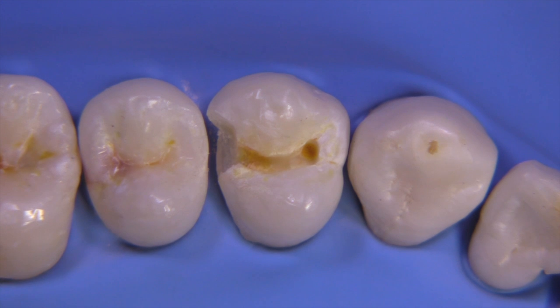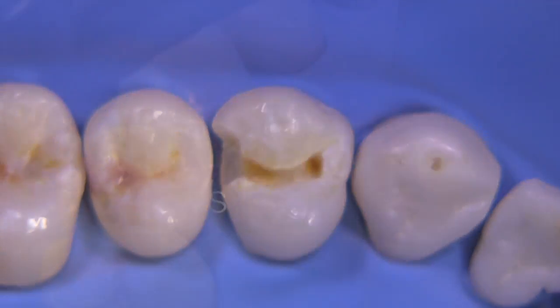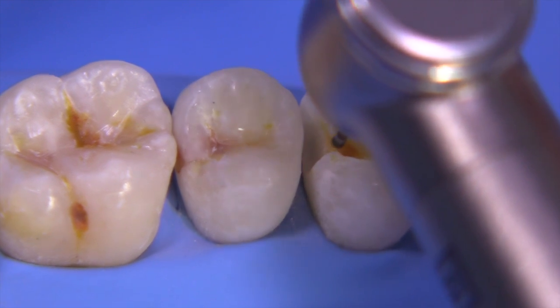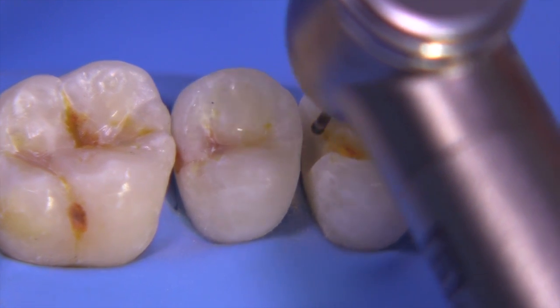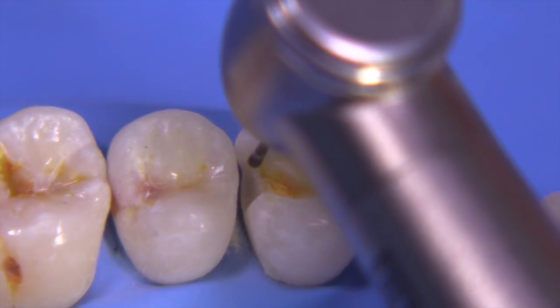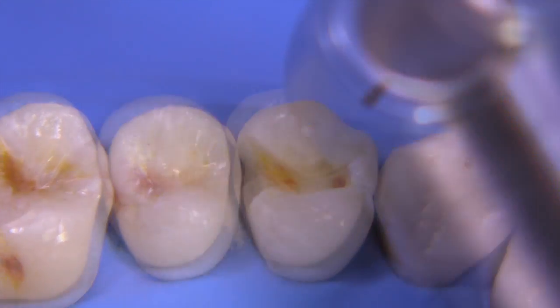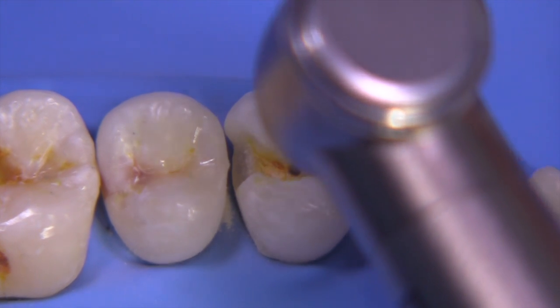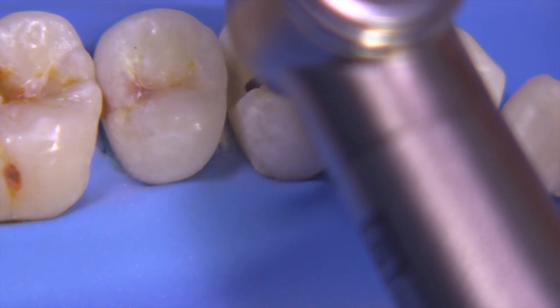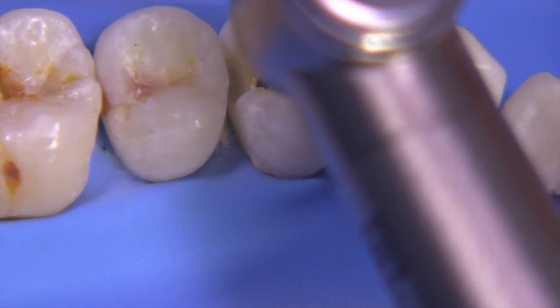Let's switch over to the 330 RGS to do some smoothing of the S-curve and open up the outline a little bit so we'll have better access to the caries removal process. The 330 RGS is ideal for generating the S-curve, maintaining the convergency of the occlusal walls, and creating a flat pulpal wall. Remember to diverge that mesial dovetail wall. This burr was developed over a year working with Brasseler so that students can make better-looking Class II preparations, particularly for board exams.